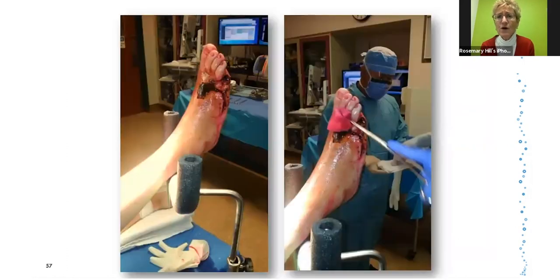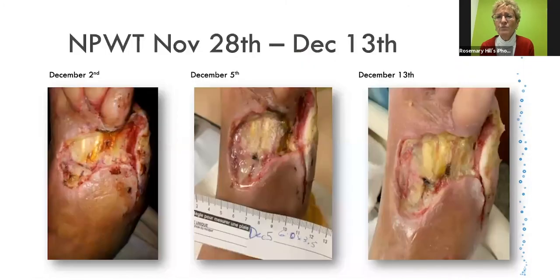So this is us in the OR doing a debridement, and right away, following debridement, we had negative pressure application, and we continued to do that for quite a while, but we weren't seeing much in the way of results. And when I say that, we weren't seeing a lot of granulation tissue in the wound bed, and you'll see what I mean by the next slide, where the wound bed just was quite pale. And so finally, we began the continuous diffusion of oxygen.